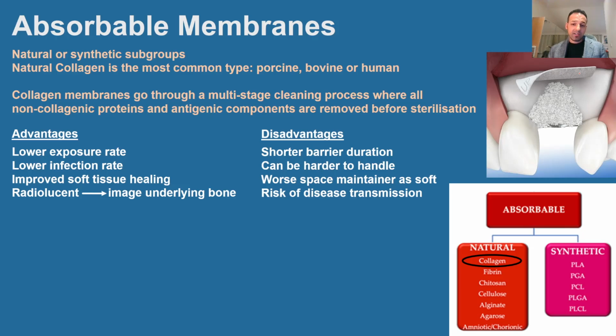It can be harder to handle because they can be quite flimsy. There are different thicknesses and materials out there. However, it's a worse space maintainer as it's soft and it collapses under soft tissue pressure or any other pressure, such as a denture, for example. And there's a risk of disease transmission because we're taking it from other humans or animals.